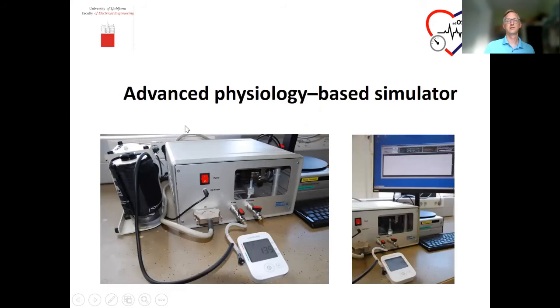That's why it was decided that we build an advanced physiology-based simulator. This is this box here. It has a special mechanical device which produces pressure pulses, which are then fed between the cuff and the device.